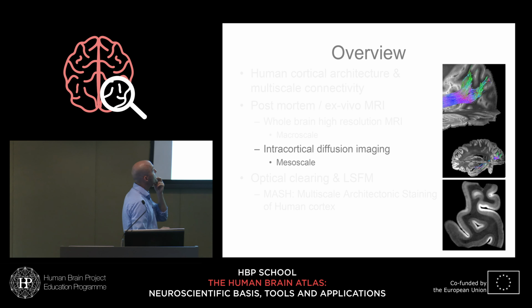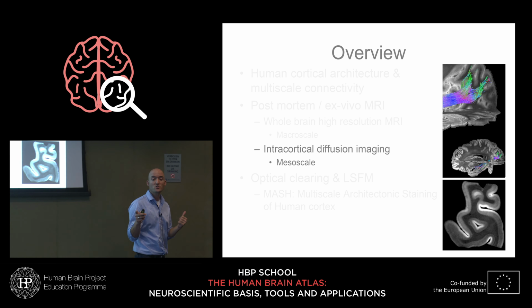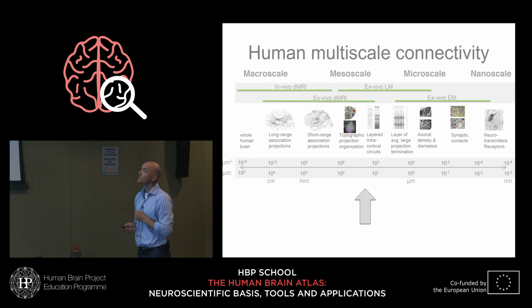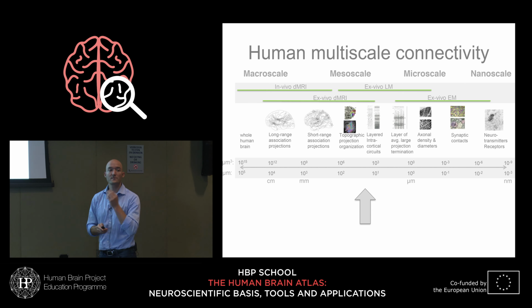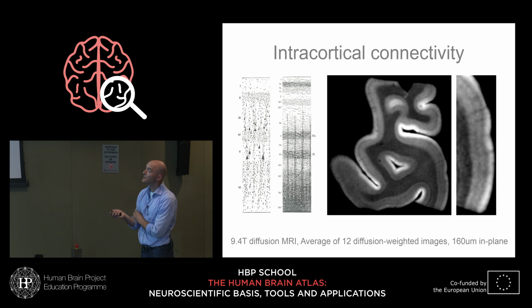All right. Let's take resolution one step further, but let's also try to answer some of your questions where it comes to intracortical and multiple b-values. And for that, we go to intracortical diffusion imaging, so to get enough resolution to have contrast inside the cortex. Now 400 microns certainly is good there, but we thought if we limit ourselves to what will still be for microscopists huge pieces of tissue, but slightly smaller than the whole human brain, can we upgrade the resolution to the point where we can look at intracortical structure?